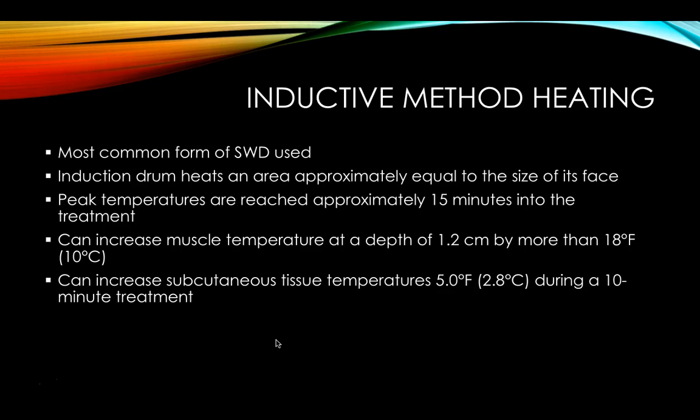Peak temperatures are reached usually in an area that's about the size of the face of the drum. So unlike the ultrasound where we had to know about the ERA and that was smaller than the face of the sound head, in this case the area is usually equal to the size of the face, plus we get that volume with the depth. Peak temperatures are reached usually about 15 minutes into the treatment.